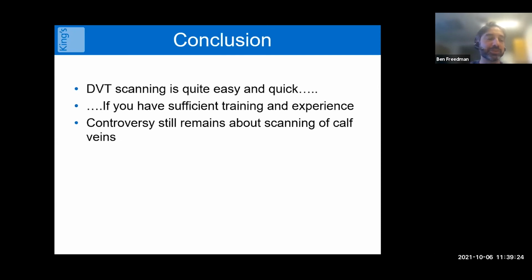service, which I should mention really, which is, as we've seen, ultrasound isn't perfect in below knee scanning, even in the best of hands. So there's the small possibility that if we think we've seen everything but actually missed a calf DVT, and we're not bringing those patients back for repeat scans in a week, there is that small possibility that something could propagate that we missed on the first scan, and without that safety net of the second scan, that could get completely missed. But thankfully, I think that's pretty rare.